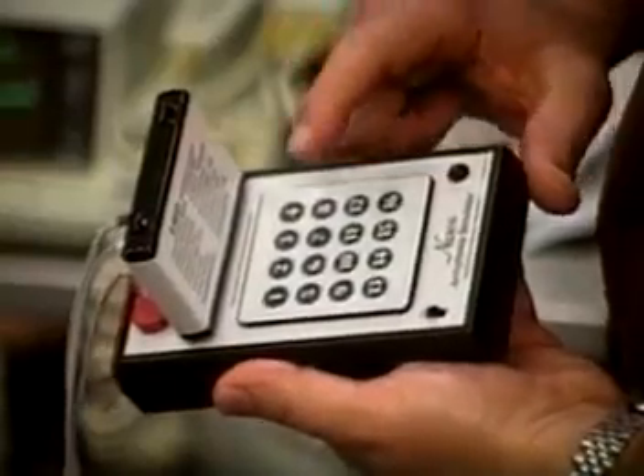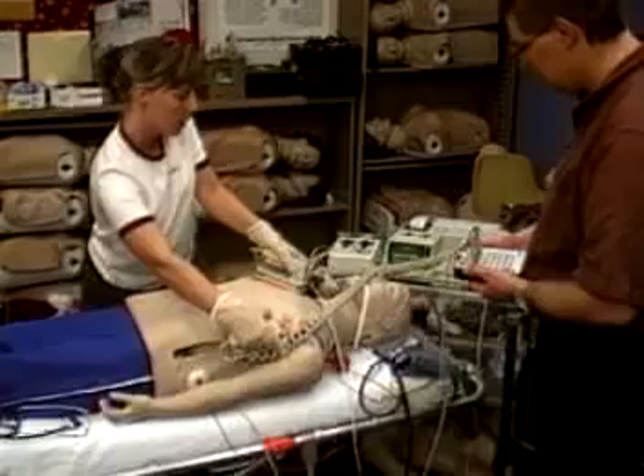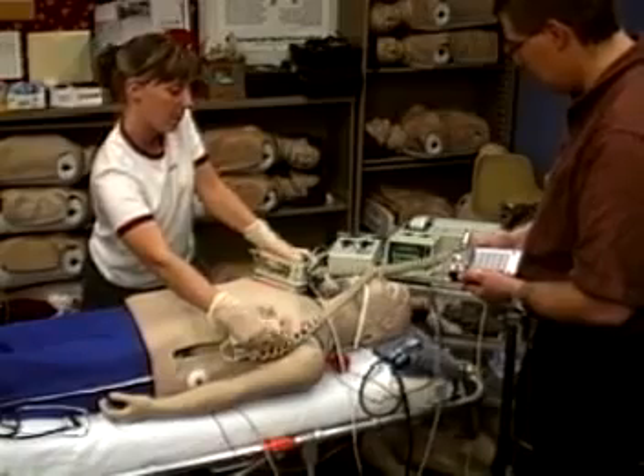When used in conjunction with a patient simulator, the defibrillation chest skin makes it possible to monitor the mannequin, just like a real patient.